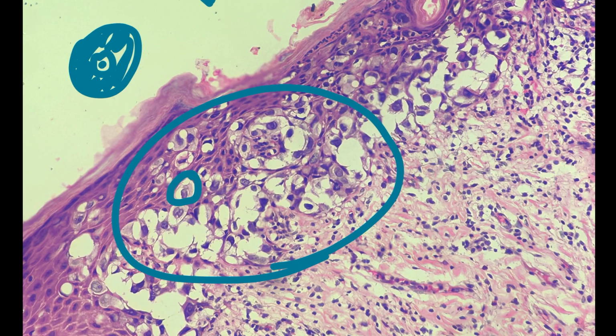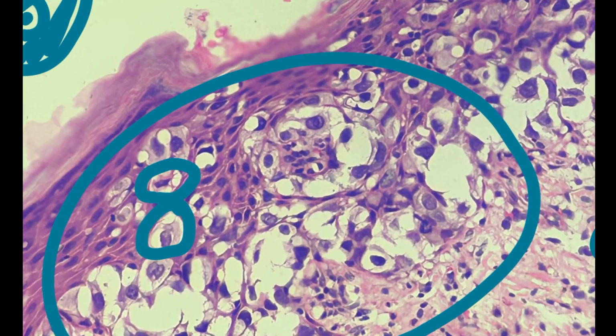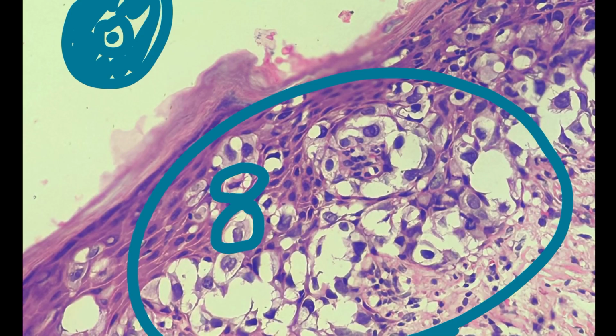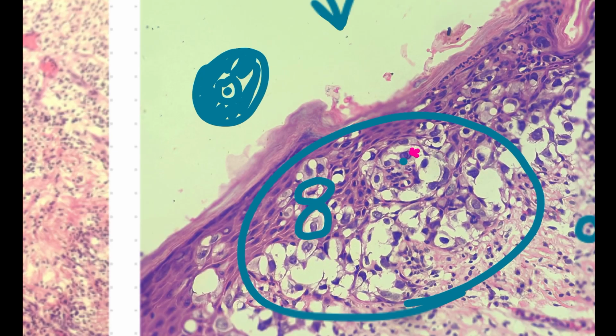The size is relatively large. How am I saying it is relatively large? Compared to the small lymphocytes that are present here. These cells are quite small, right? And the cytoplasm, can you appreciate any cytoplasm here? No, they have very little cytoplasm. Compared to that, each cell that you see here has abundant cytoplasm. If you zoom in again, can you see that there is a large nucleus, and inside the nucleus there is a round, prominent nucleolus? This is how you describe a Paget cell.